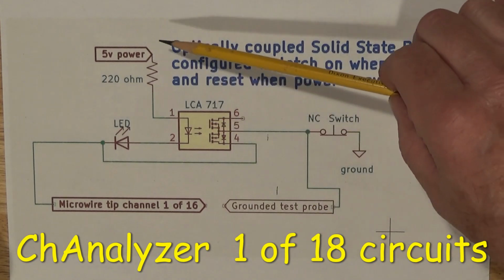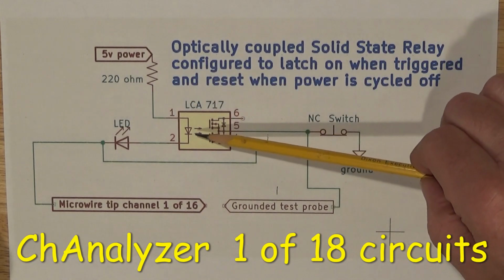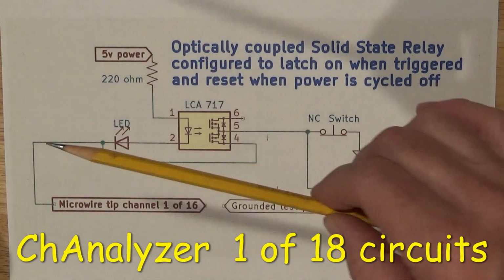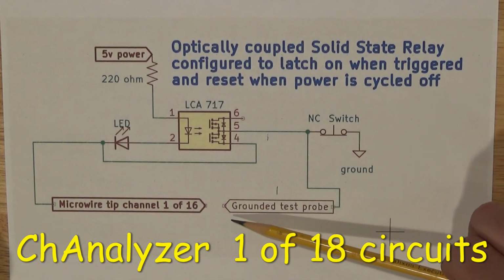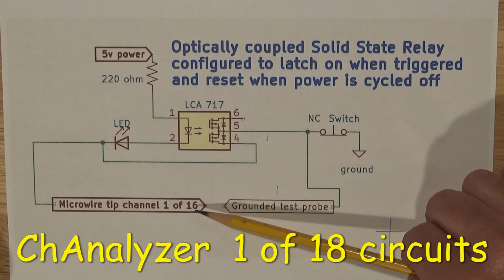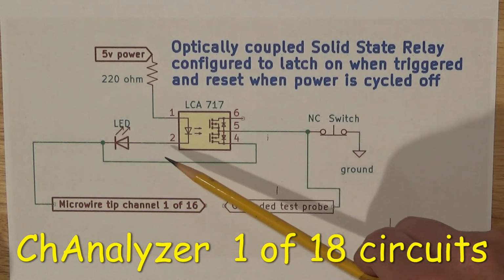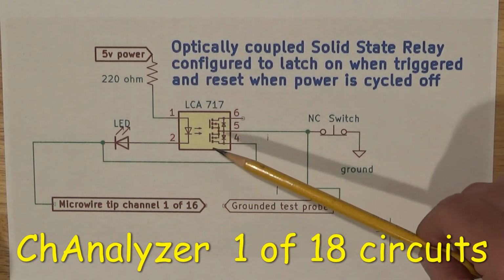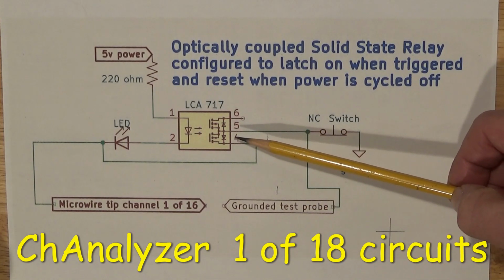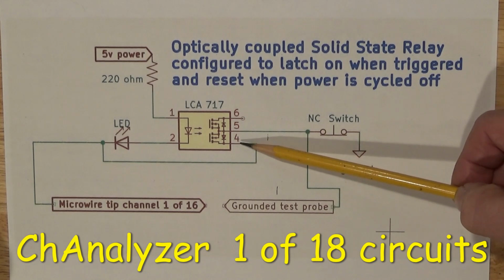And so you can see there's a 220 ohm current limit resistor, there's an internal LED and an external LED, and they're in series. And so when the grounded test probe makes contact or conductivity through one of these channels, the electrons flow through both LEDs, and when they do flow, they activate this device, and they connect pin 5 to pin 4.